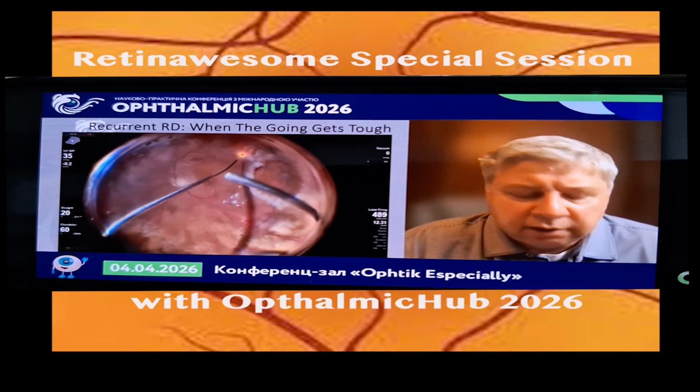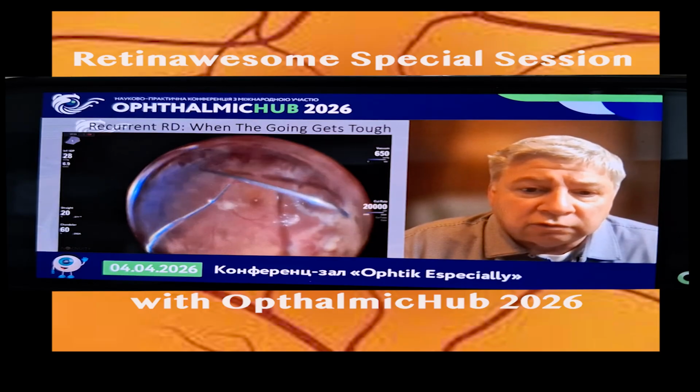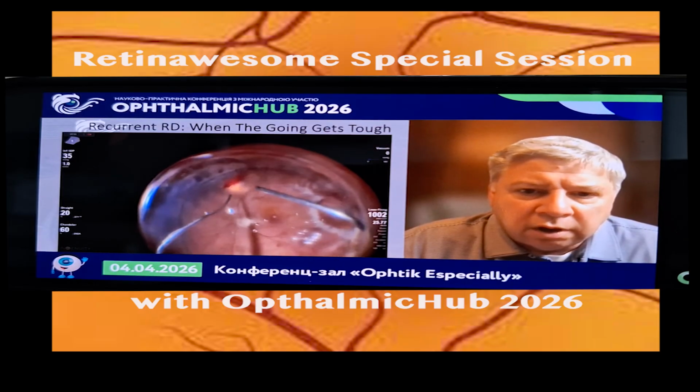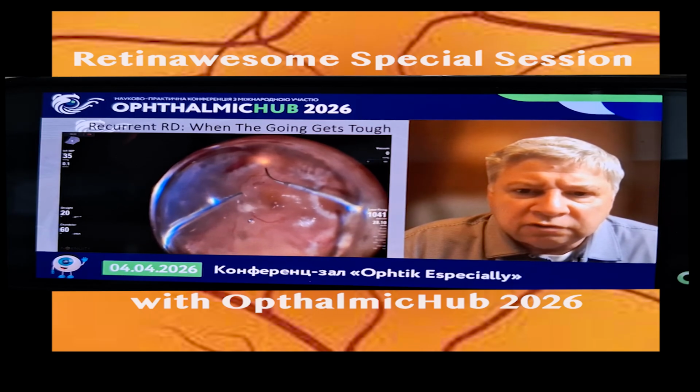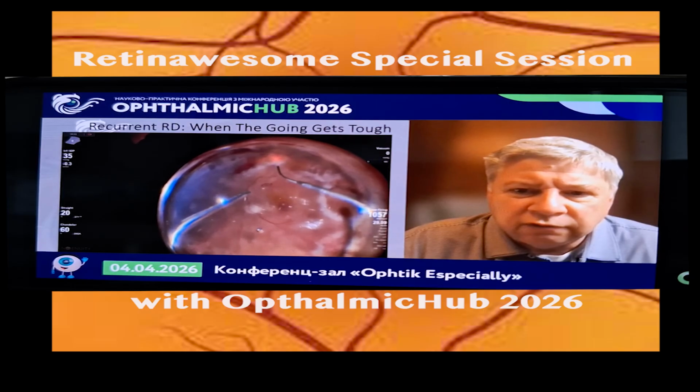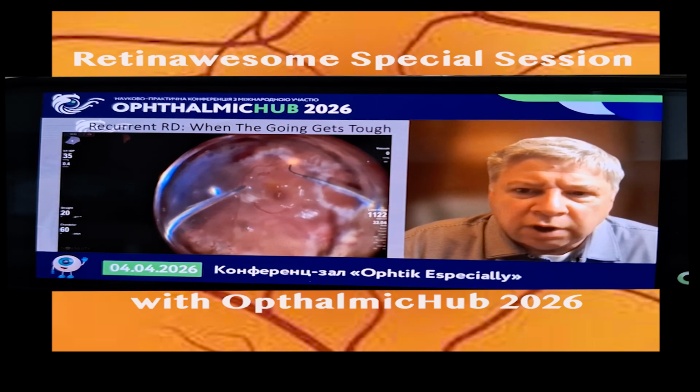This has really worked well in our hands, even for the retinal foreshortening, especially for inferior pathology. This medium-acting perfluorocarbon tamponade just works really well. And so we've kind of released the traction temporally. There was still some foreshortening inferiorly, and we made a few retinotomies.